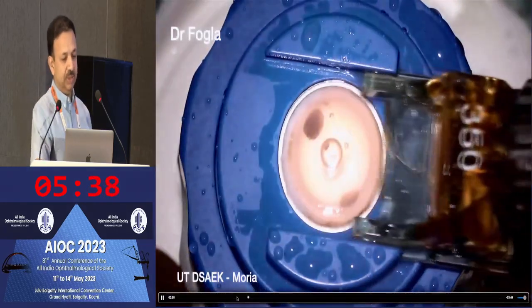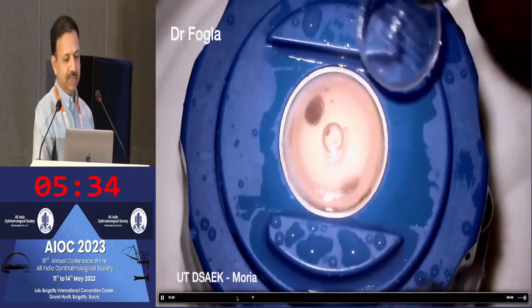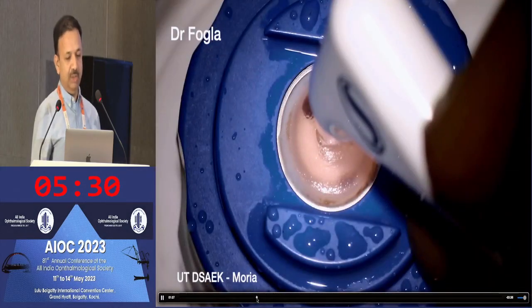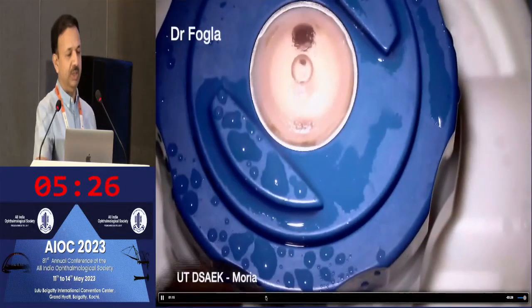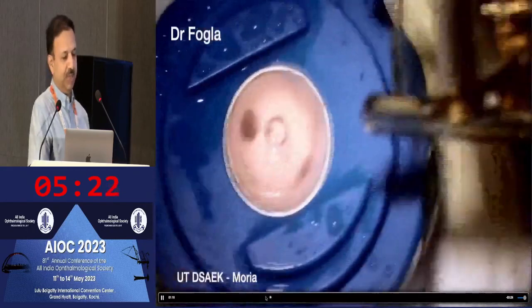This is using the Moria SBK microkeratome. That's the anterior cap that's removed. After which we perform pachymetry again, and you find that the reading is now showing 210 microns.